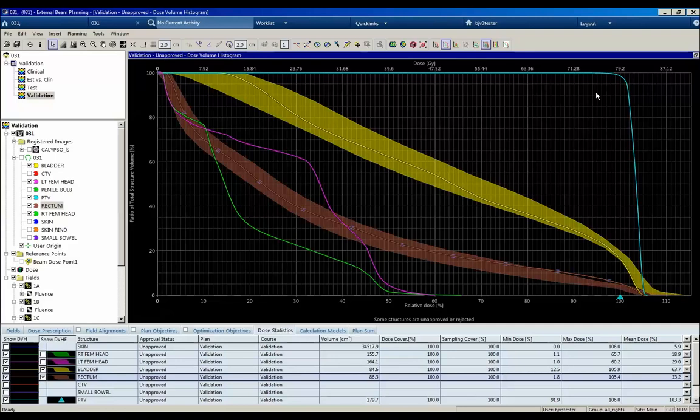On the other hand, if the optimized DVH meets the lower bound of the DVH estimation at the expense of the PTV coverage, or the optimized DVHs never meet the upper bound of the DVH estimation, but the PTV is well covered for all patients, this might indicate that the RapidPlan model optimization objectives should be modified to find an optimal balance between PTV coverage and organ at risk sparing in the model configuration workspace before continuing with the validation process.